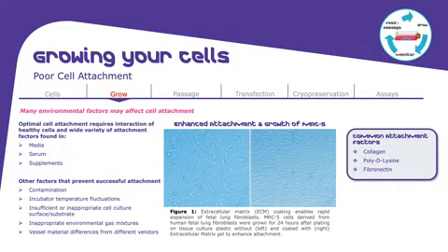All these things you need to take as a sign that something is disturbing normal cell growth, because the usual media, serum and supplements should help cells to attach. As I mentioned, you can also use extracellular matrices or attachment factors like collagen or fibronectin or laminin in order to enhance attachment and growth of the cells. Use it as a control.